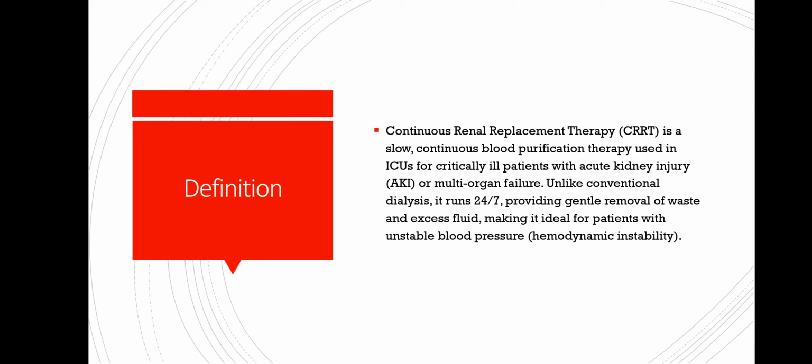Unlike conventional dialysis, it runs for 24 hours, providing gentle removal of waste and excess fluid. It is ideal for patients with unstable blood pressure, which is also known as hemodynamic instability.